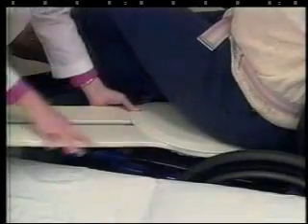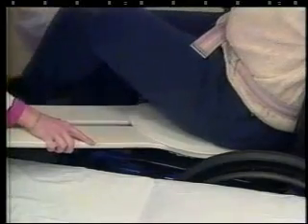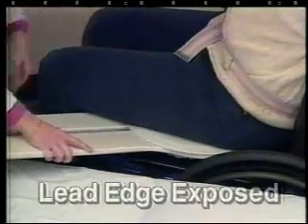Use a transfer belt on the patient's hips for increased control. The next step is to place the seat under the patient's upper thigh. It is very important that the lead edge of the seat remain exposed.